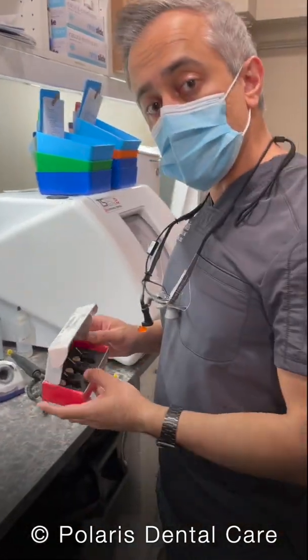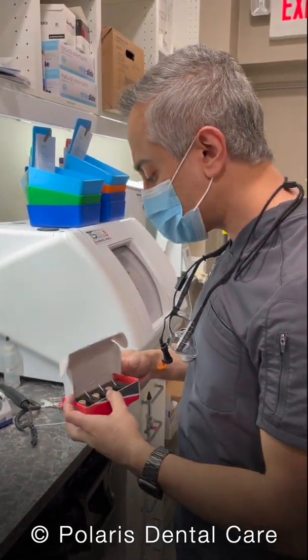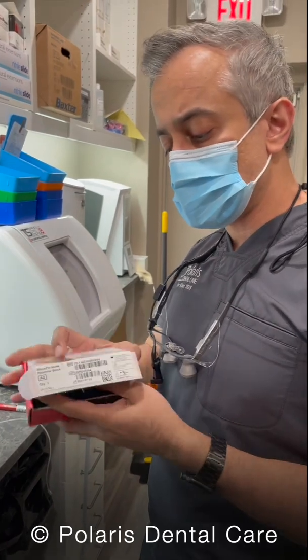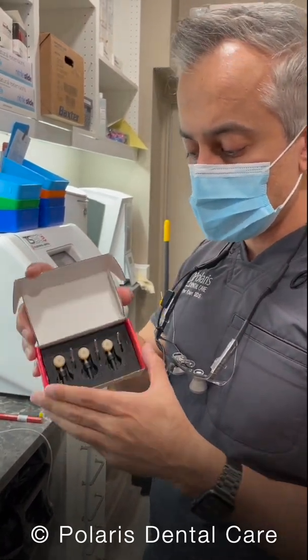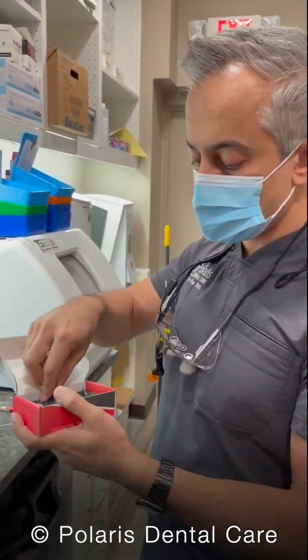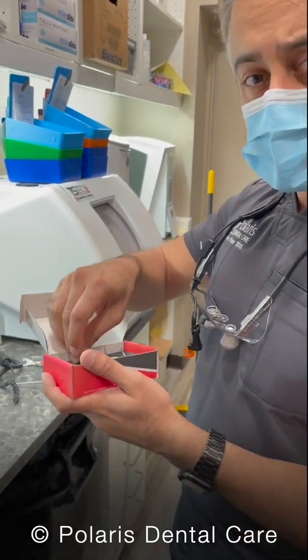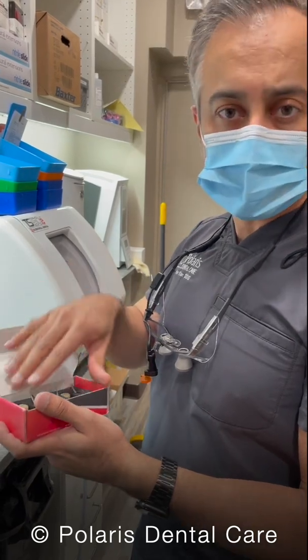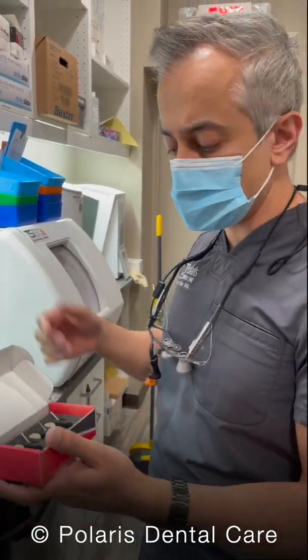This is another video on how to mill one of our Bruxer Now blocks. Every Bruxer Now block comes in a box like this, and inside you're going to see there are three pucks along with a burr for every single one of those pucks. You change the burr for every single use because if you try to reuse one, it'll break and you're going to ruin the crown.